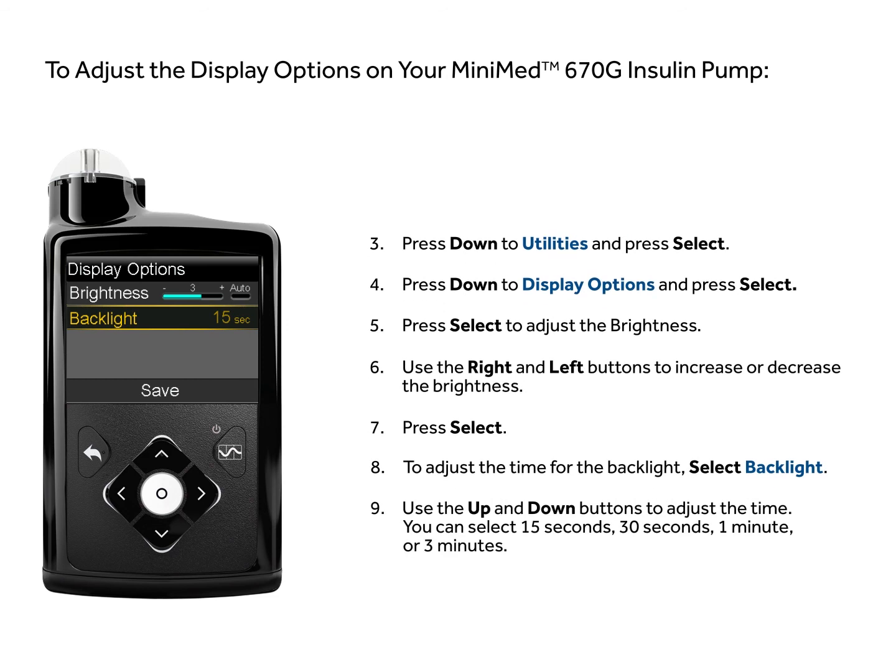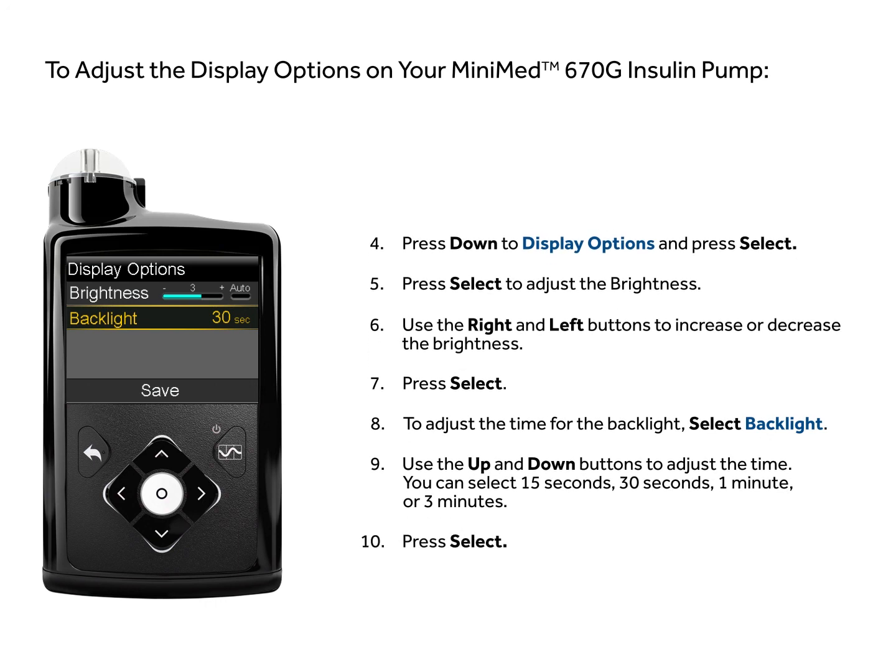Use the up and down buttons to adjust the time. You can select 15 seconds, 30 seconds, 1 minute, or 3 minutes. Press select.